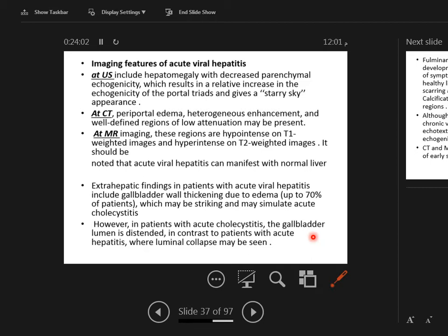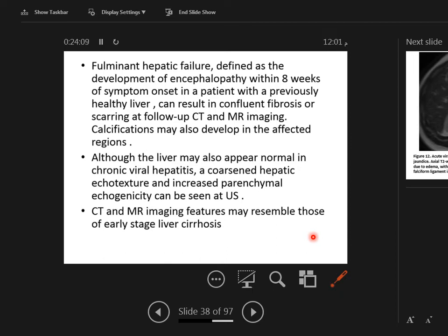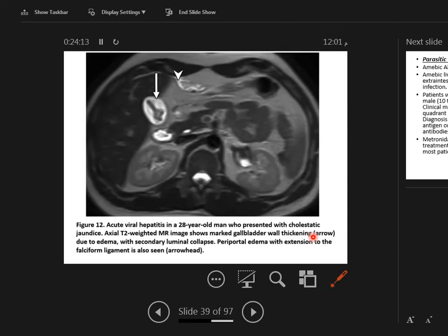Of course, why did I not mention that? Because if you see ascites, it's a very common differential diagnosis for the cause of the ascites. Sometimes you have normal findings. Sometimes gallbladder, ascites is common.